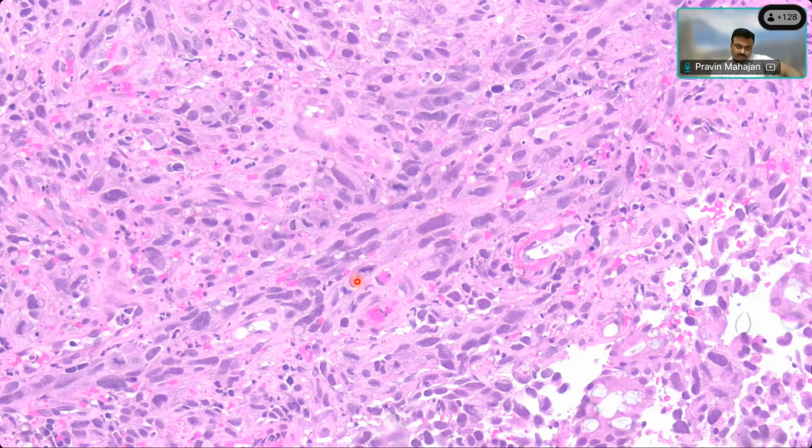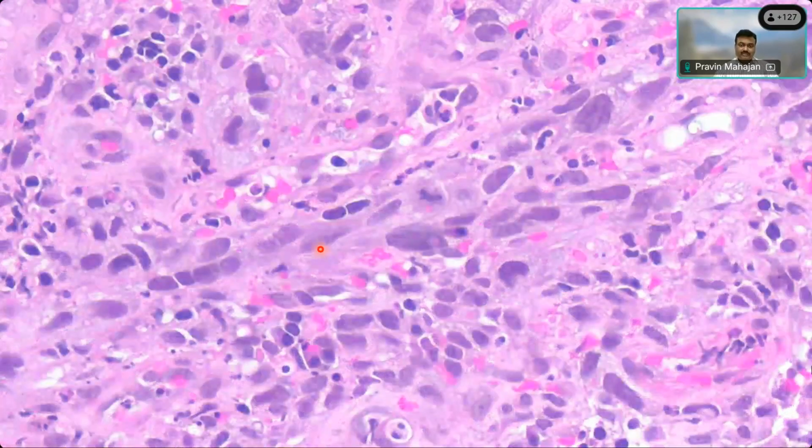There is some, you see this, what is this? I'm circling. This one looked like a mitosis. Yes, so there are mitotic figures. There are 1, 2, 3 at least here within this small area, and here one also. So it is very mitotically active, showing a lot of nuclear pleomorphism. This tumor has a spindle cell morphology. Brisk mitotic activity, we like to call it, right? Yes, sir. Very good.